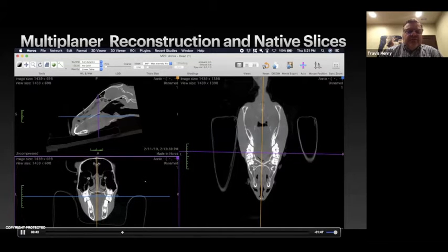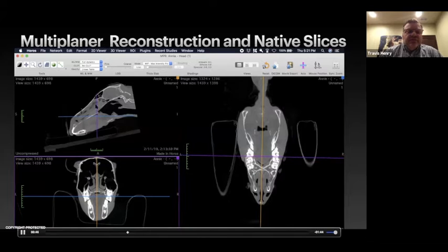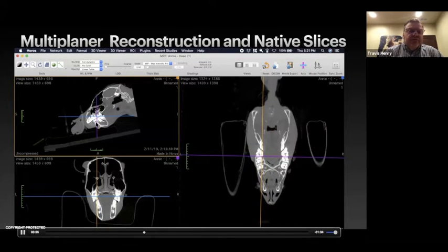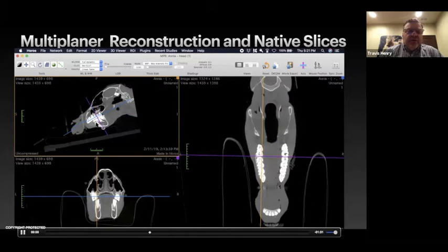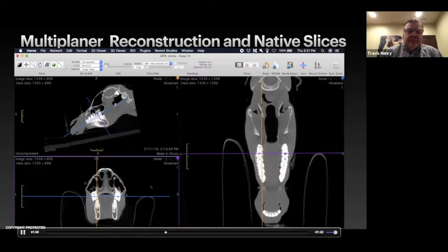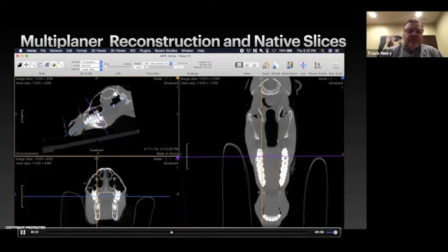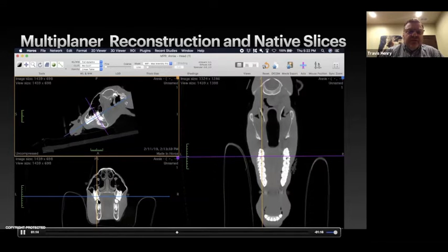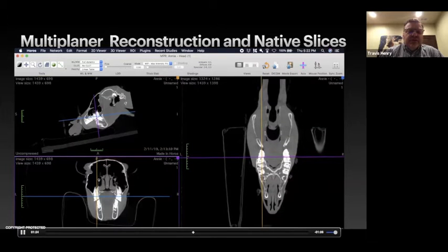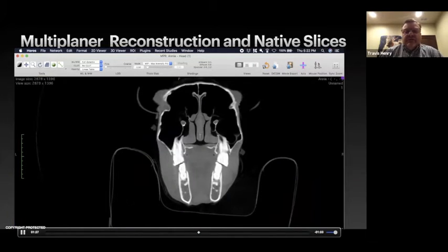But there's a good reason sometimes to reposition this line so that we're actually following a tooth. So say, let's go look at the number 11 tooth that angles distally, and a lot of times we're going to want to be right on that tooth. So here we're going to look at the 9, so we can see those coming into view nicely. And then as we go back a little bit farther, we want to look at the 11s, because you can see here we're seeing part of the 10 and part of the 11. So I can angle that back. And now I'll be able to scroll back through the slices a bit and get both of the 11s individually there so that I can compare right from left.